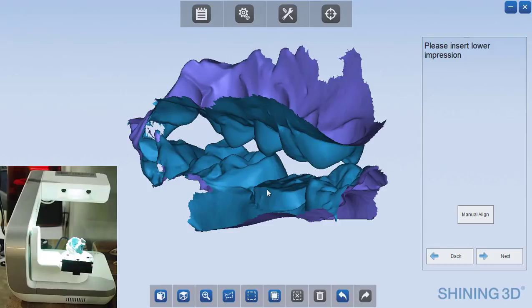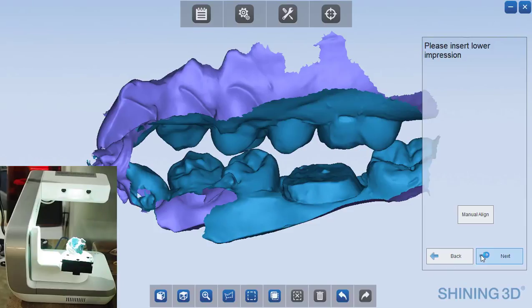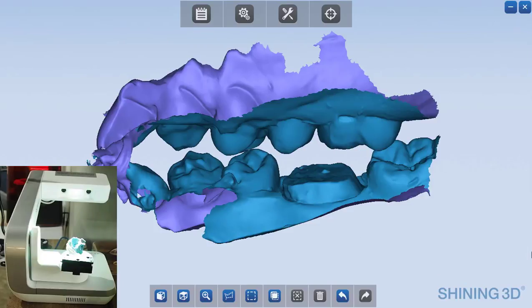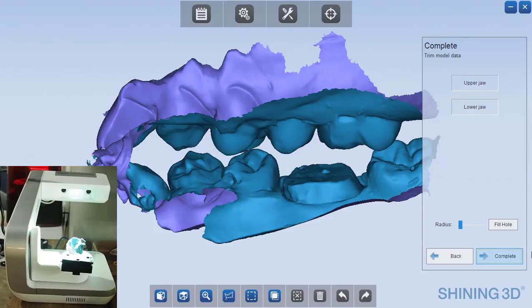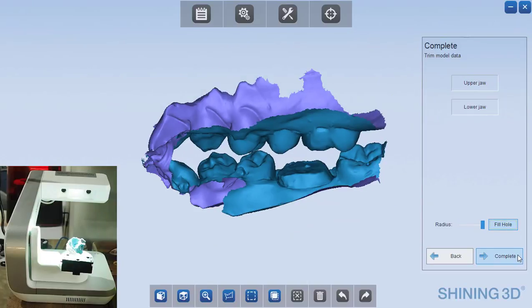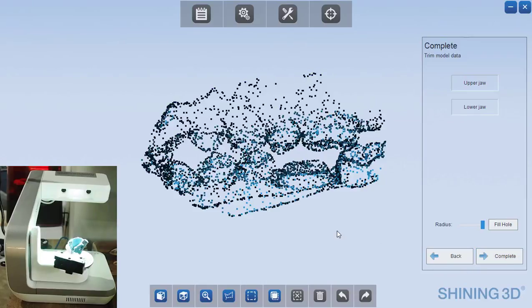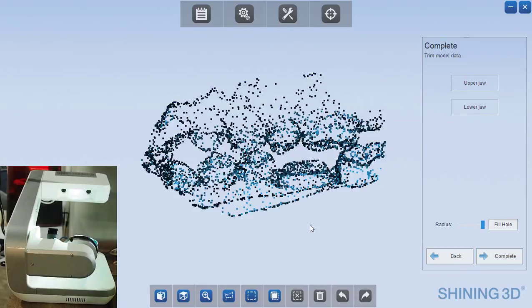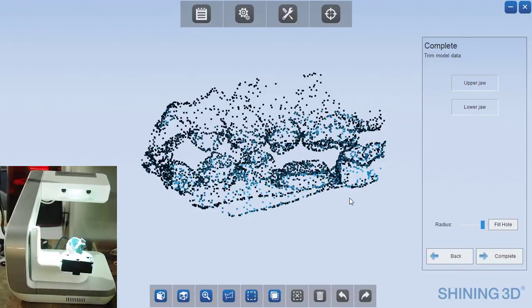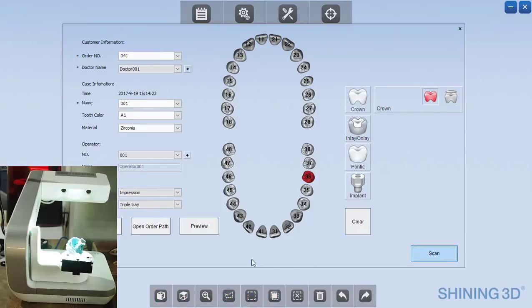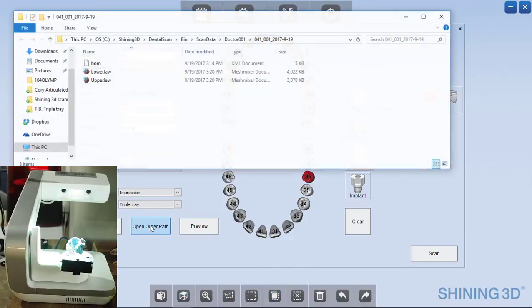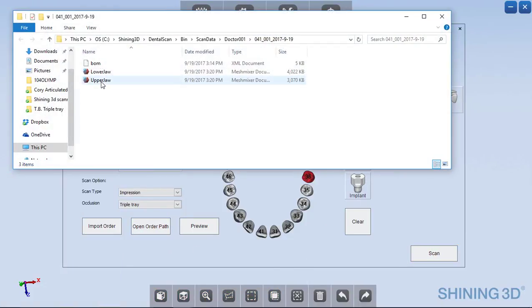So this is the completed impression. Now we click next and everything is completed. If you needed to fill any holes in the mesh that might have been left, you can do that and then just push complete. And now the impression scan is done and you could open the order path to view this.